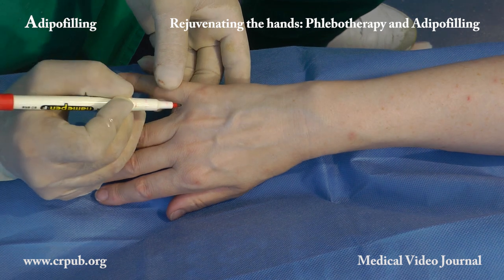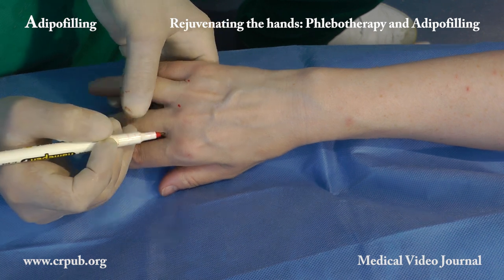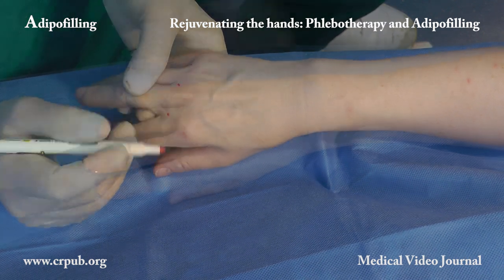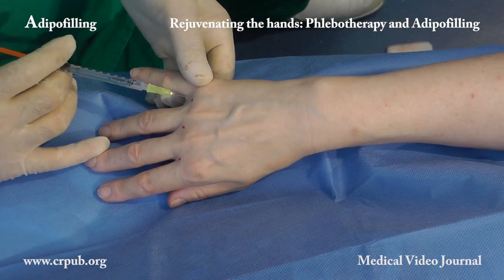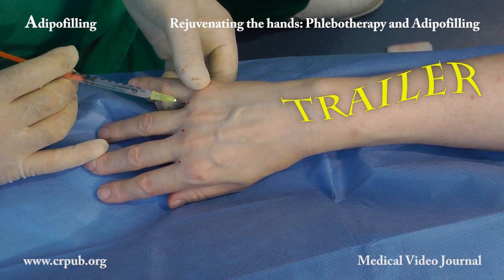In the meantime, we use a dermographic pen to mark the points of access of the cannula. An anesthetic solution containing epinephrine is injected at these points.